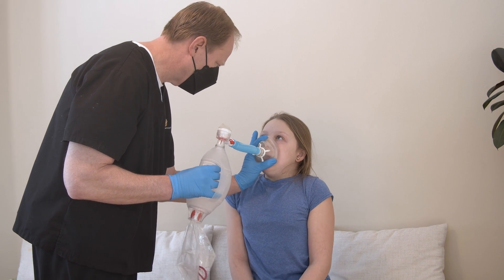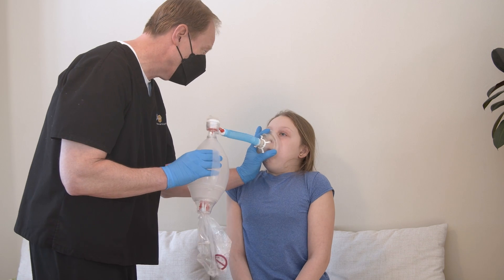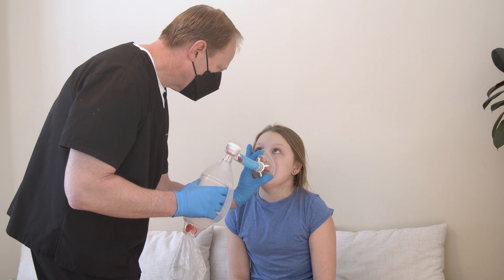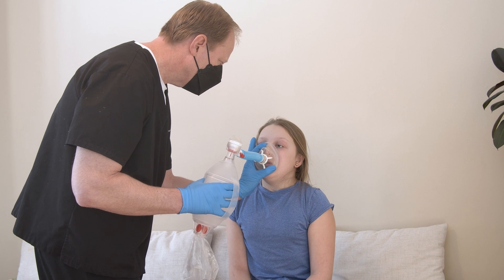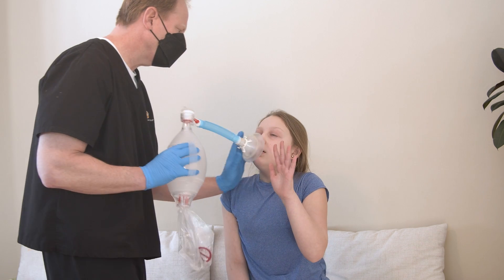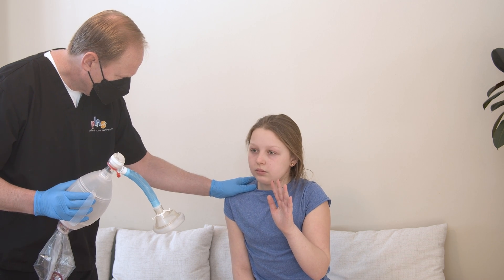Monitor your child's color, heart rate, and comfort level during the cycles. If your child experiences dizziness, high heart rate, or chest pain, stop the therapy. If symptoms continue during the next cycle, contact the health care provider.